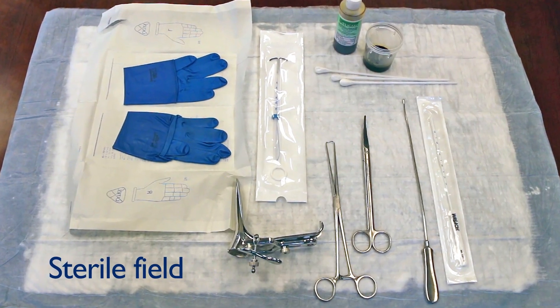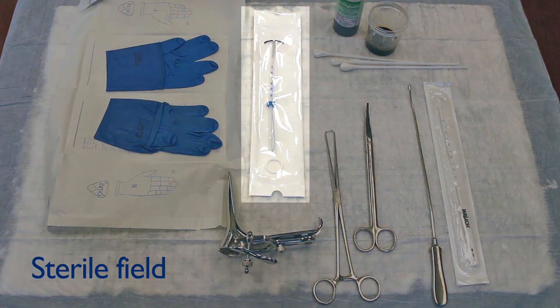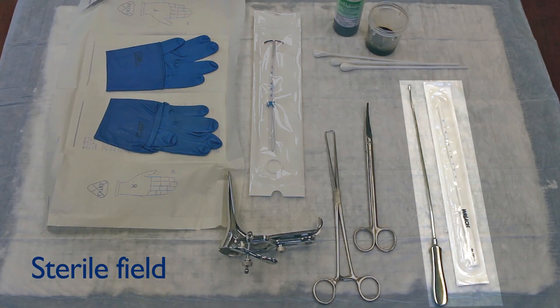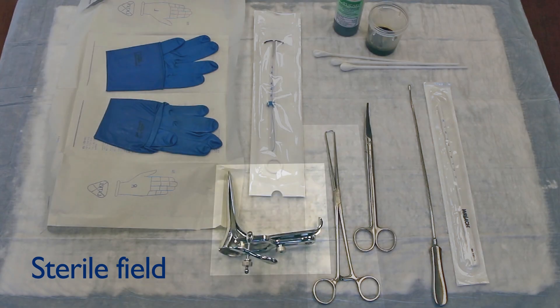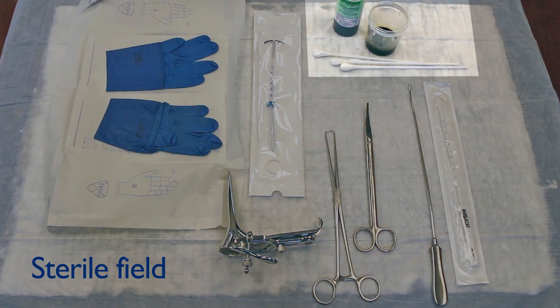For this IUD insertion, you will need these instruments and supplies: hormonal IUD in its sterile packaging, gloves, uterine sound (either disposable plastic or metal), tenaculum, speculum, blunt tip scissors, and antiseptic solution and swab.